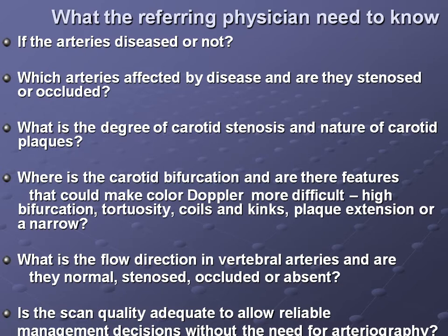You should tell him, I'm satisfied with this scan or not. If I'm not satisfied, what do I recommend? Okay? Because he's not there with you to see. You should tell him.